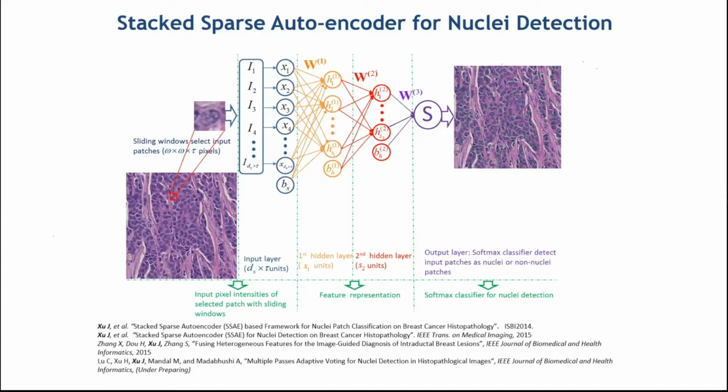And so this was a paper we published a few years ago where we showed one of the first examples of deep learning applied for cell detection in pathology images. We showed that simply by standing up one of these networks, by providing it a large number of well-annotated training exemplars, you could actually get a result that looked like this, where essentially on a cell-by-cell basis, you had a segmentation, you had a result that popped out.